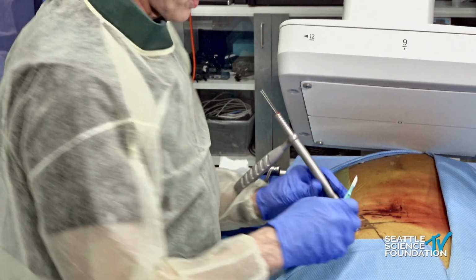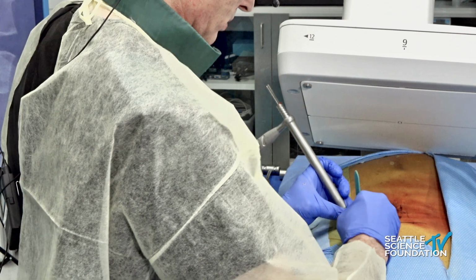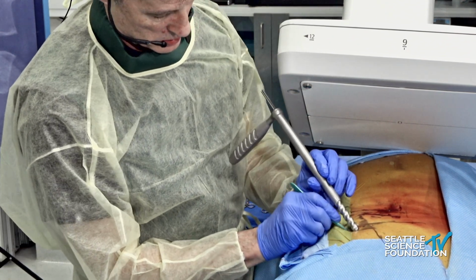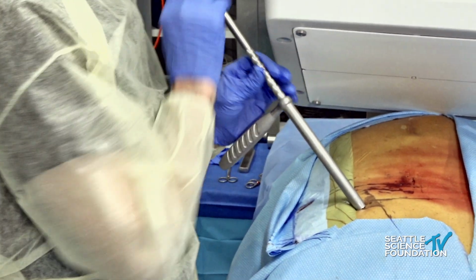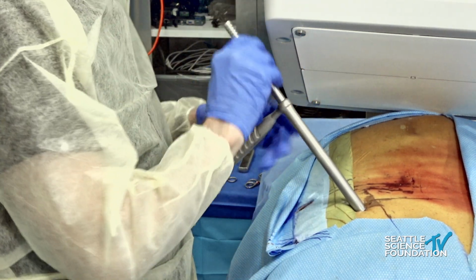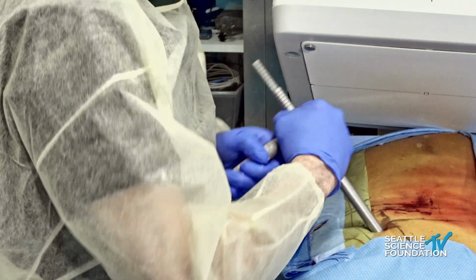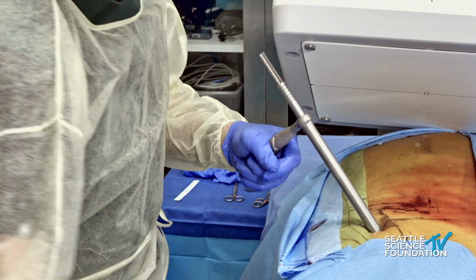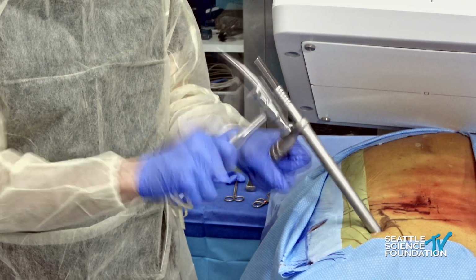I'm going to make my incision just a little bit bigger. All right. And I'm going to make sure, and Doc, you can always use the working channel and hammer on the proximal neck of the working channel.